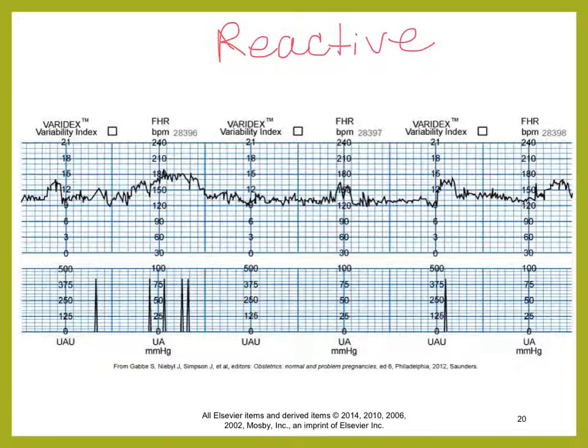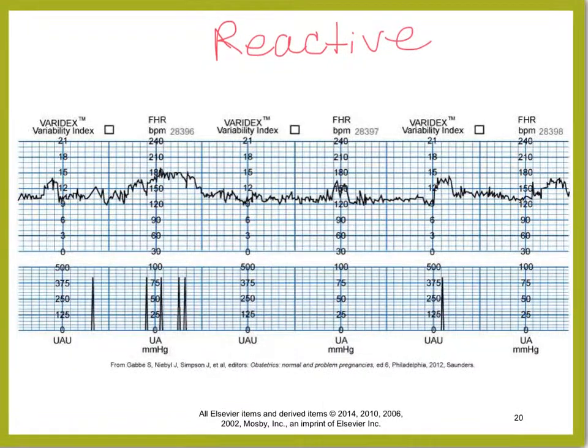So when we talked about the little square, this teeny little square here is 10 seconds in time. If you look, this is a dark mark, and then right underneath the numbers is a dark mark. That's your block of 6, which makes it 1 minute in time.